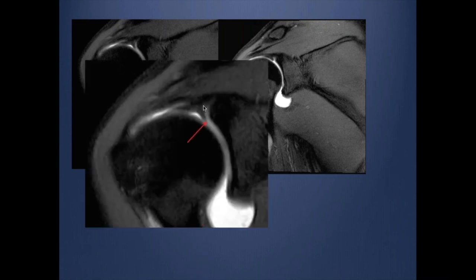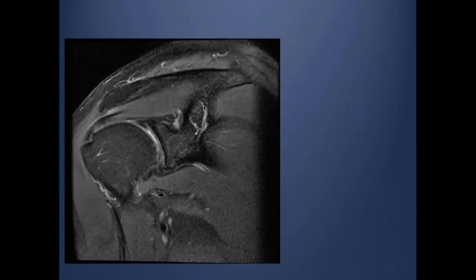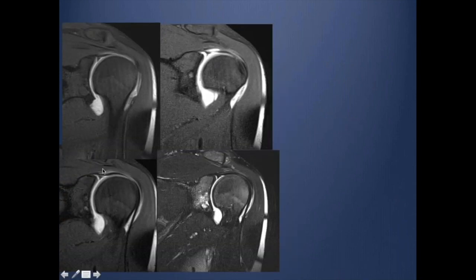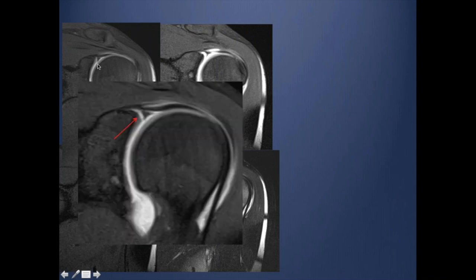This looks like more of a variant — a sub-labral recess. If you look at this next one, we have abnormal signal that does go laterally within the biceps anchor. So this is definitely a SLAP lesion. In this case, you can see it is more than 3 mm, so this is another case of SLAP as well.